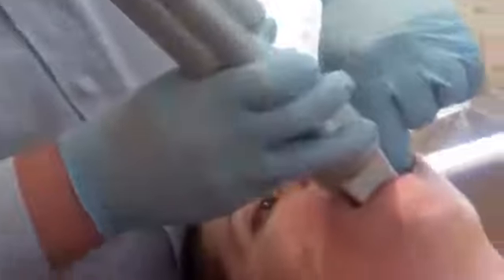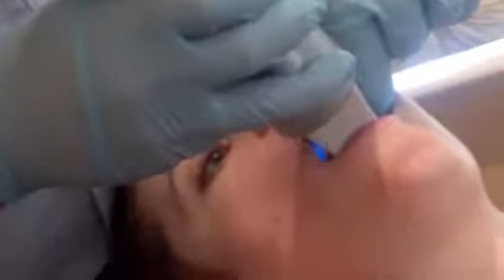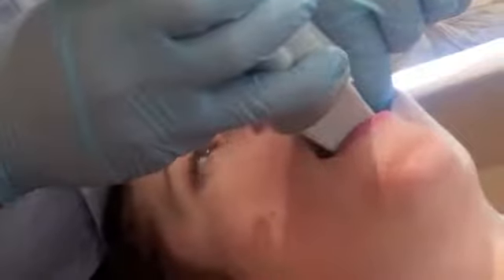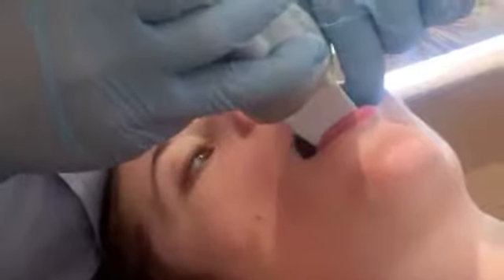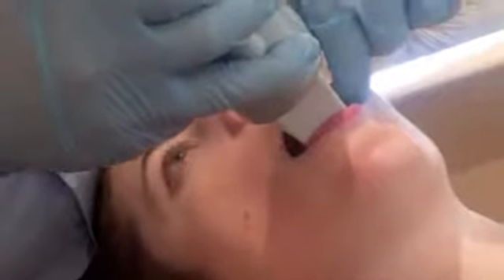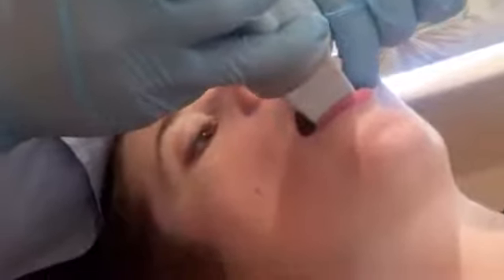Why is the wand flashing? It's got like a rangefinder in it, so it needs to be within, I think it's 15 to 18 millimeters before it will focus. Please retake scan. Palatal view of upper left 4. That helps it work out whether it's focused. Segment finished. Okay, left 5.